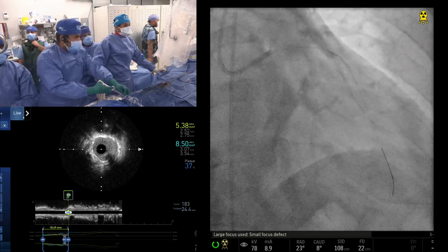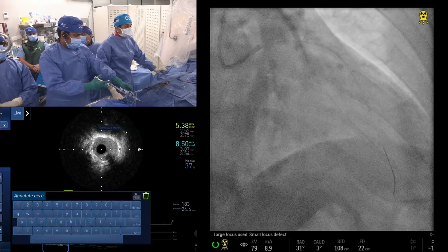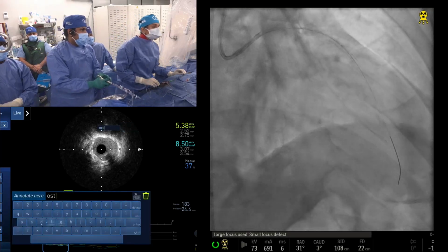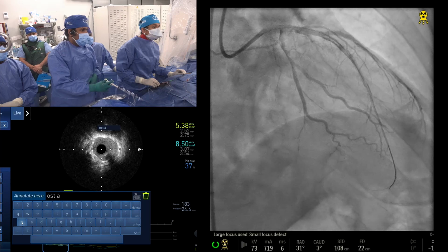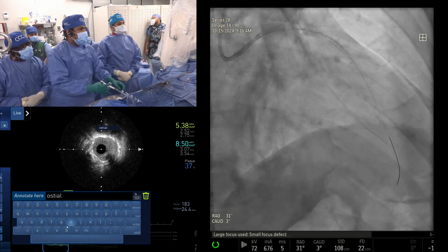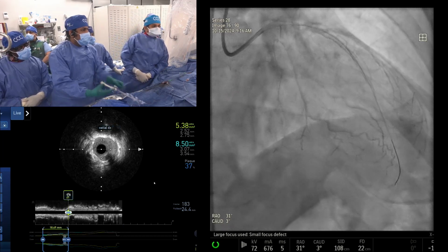That is what threw the tandem heart out of favor, what is putting ECMO in. Yeah, exactly. That is correct. So probably no, the dissection looks more, actually, both in the mid. Yeah. Right. I think you need to do something there based on that.